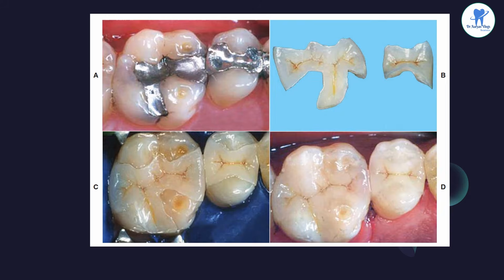However, all ceramic restorations are at greater risk for brittle fracture than the other restorations. The newest materials have improved physical properties and can be strengthened through the use of resin-bonded luting agents.